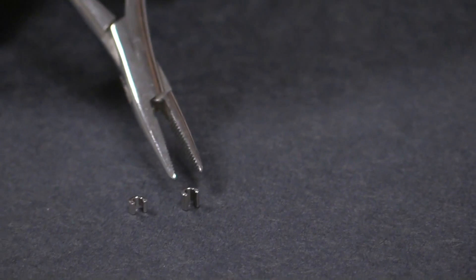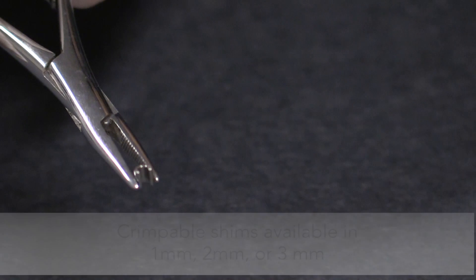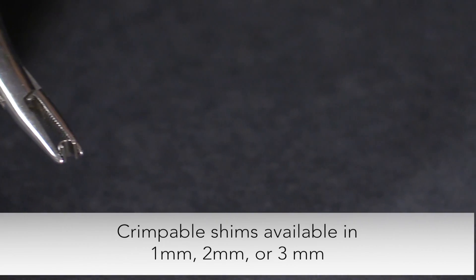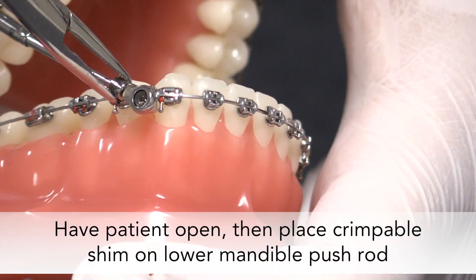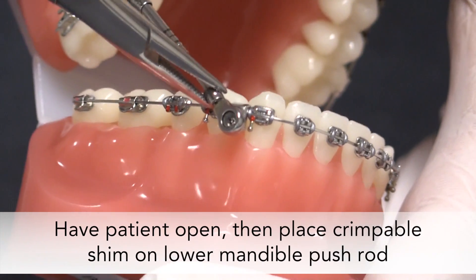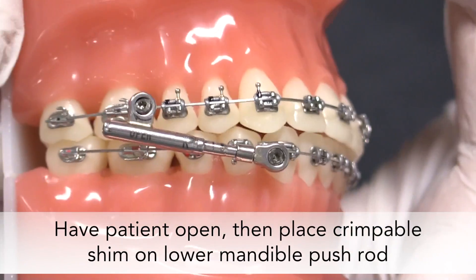Next, determine the size crimpable shim needed for activation of the appliance. Crimpable shims are available in 1, 2, and 3 mm sizes. Have the patient open and place the crimpable shim on the lower pushrod, making sure that the shim is flush with the lower screw housing to avoid over-activation of the appliance.